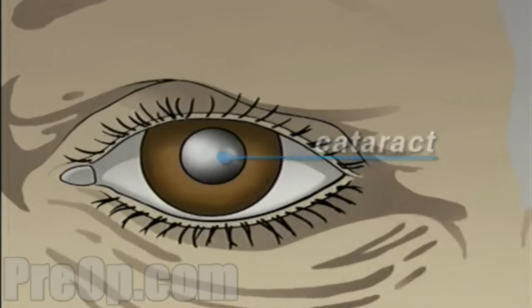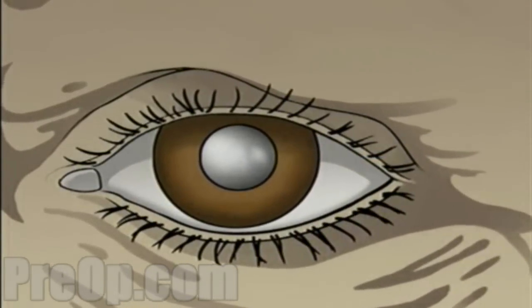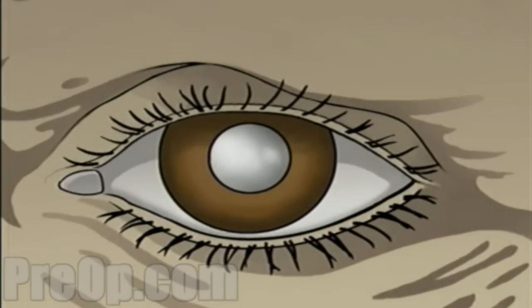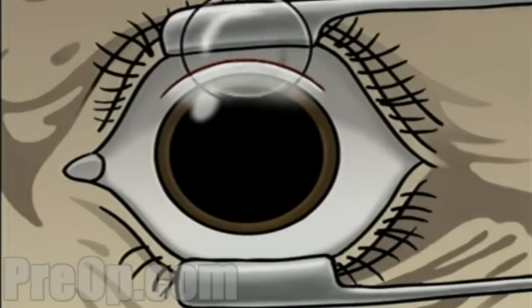If left untreated, a cataract can grow steadily worse, interfering more and more with your vision. Generally, replacing a cataract with an artificial lens is a simple procedure. It usually involves a single incision in the white of the eye. Through this single opening, the cataract is removed and the artificial lens is inserted.